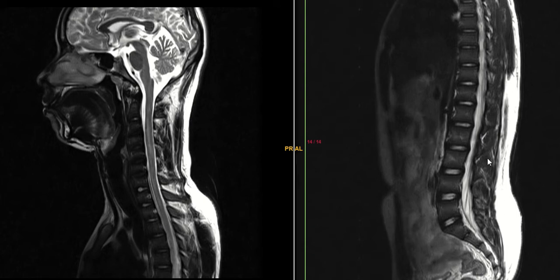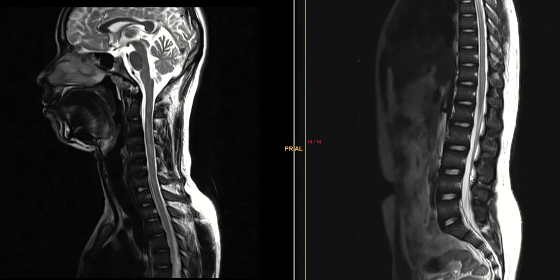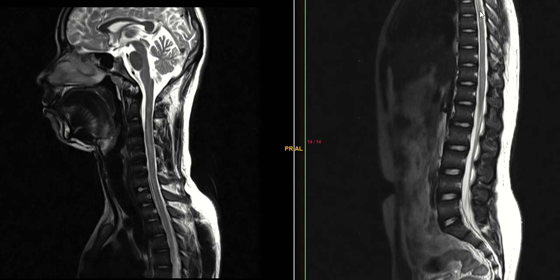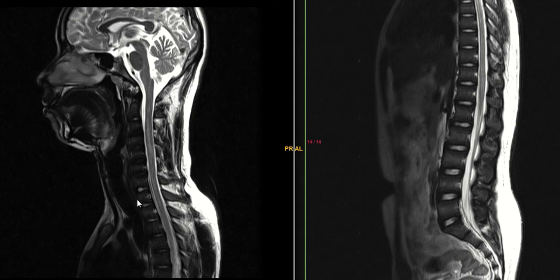NMO — neuromyelitis optica — could be one of the differentials, especially when there is optic nerve involvement. Other than transverse myelitis on the thoracic cord, maybe a bit of syringomyelia, but it's not as hyperintense. It's on the cervical level, so I will give these two differentials. Let me know if you think of any other differential. We don't have axial images unfortunately.